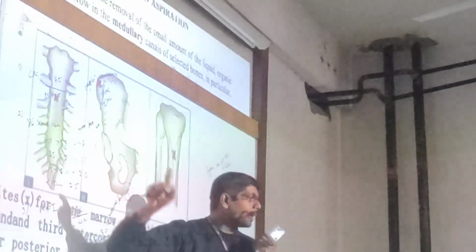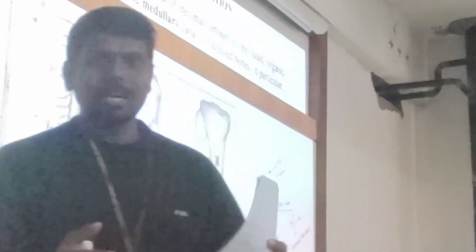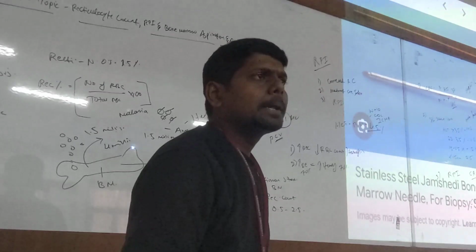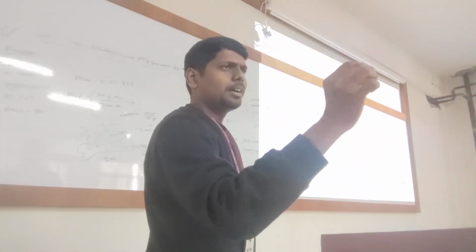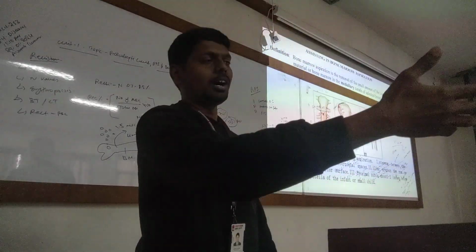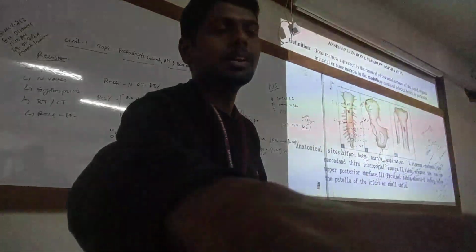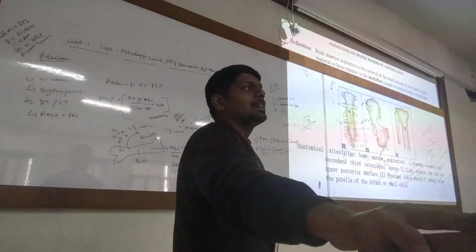Okay. So yeah. Now, I don't know whether you are understanding this or not. I will go to the next topic. This is a needle. What is the last one? Long bones. But long bones are the least preferred. The least preferred is the last, fibula, tibia. Okay, the large bones, long bones.